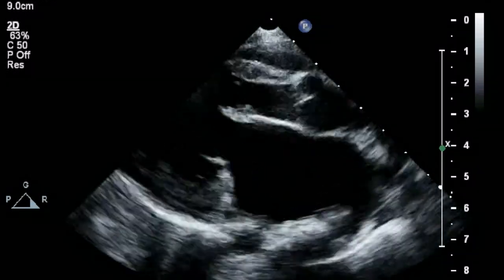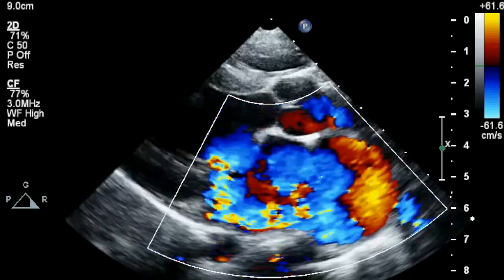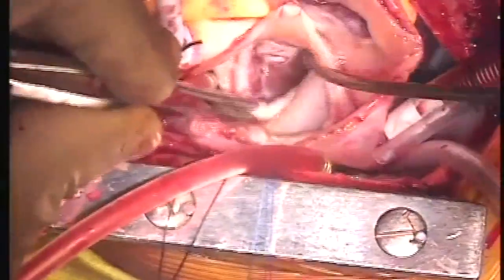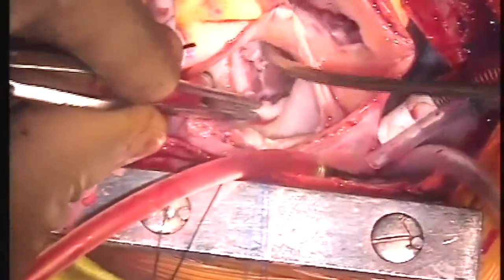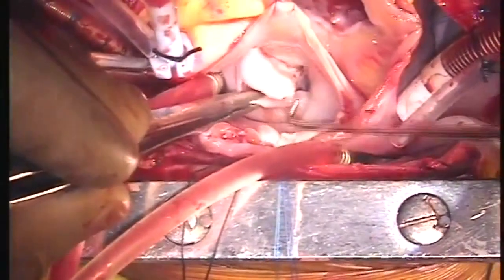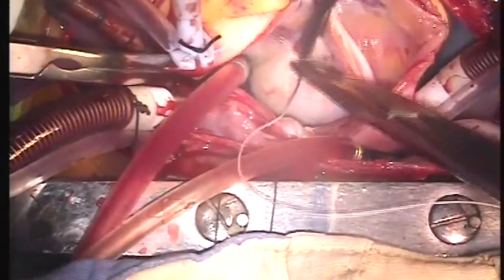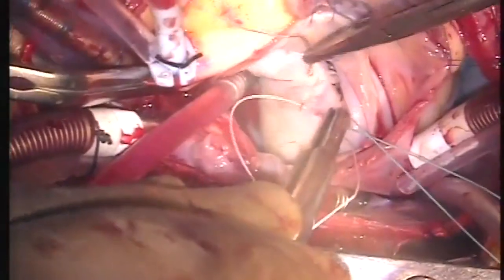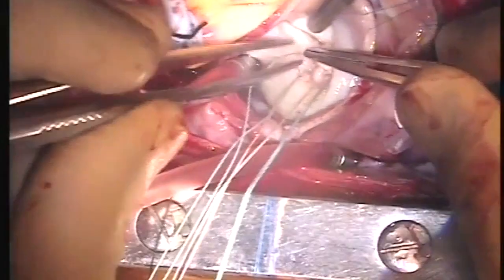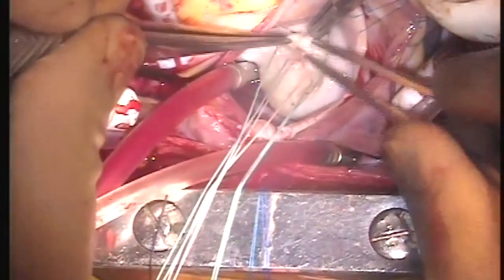Here you can see the mitral valve is pliable with a dilated annulus, A2 is prolapsing and restricted PML with severe eccentric mitral regurgitation. Mitral valve assessment performed, we could see a PML restricted and A2 which is prolapsing. Now the annuloplasty sutures are taken and then the PML peeling is performed. But inadvertently I created two holes in the PML.